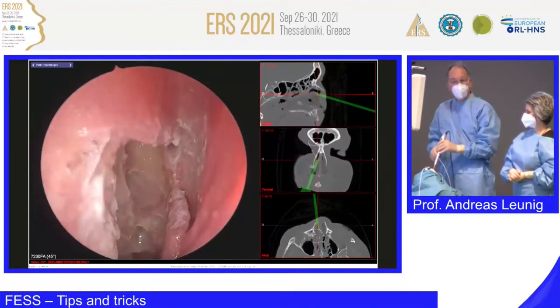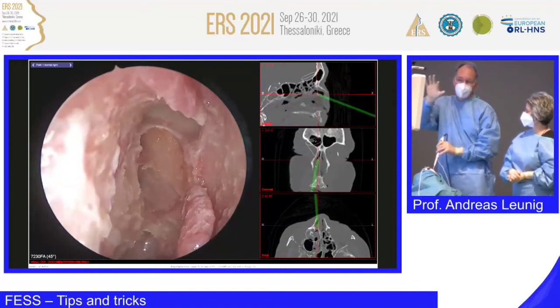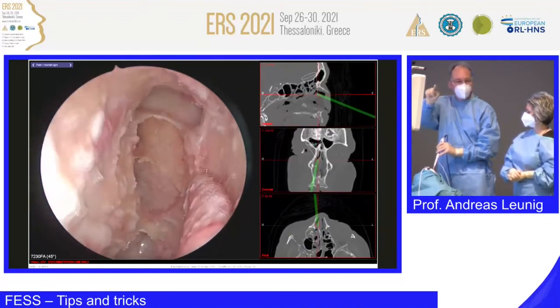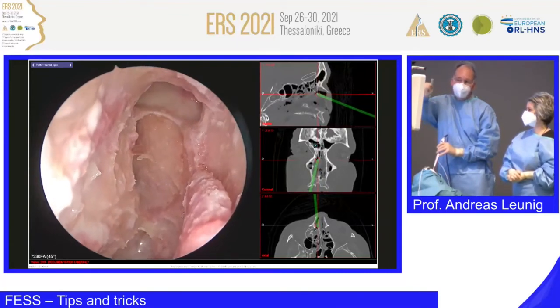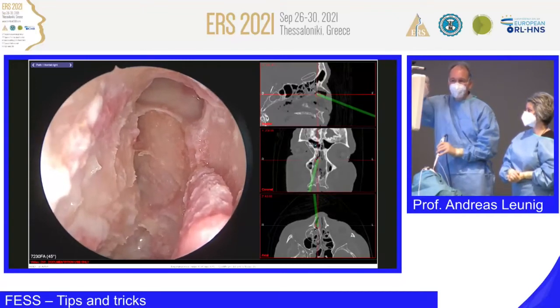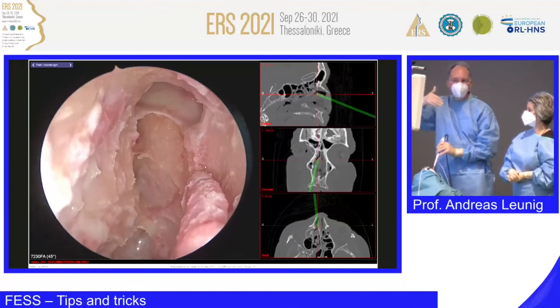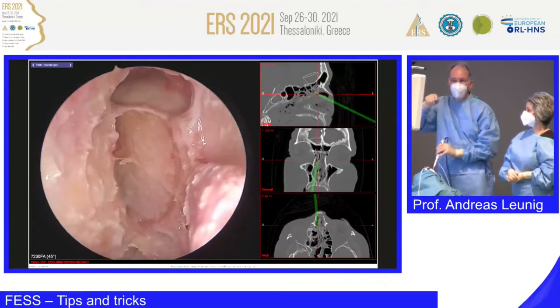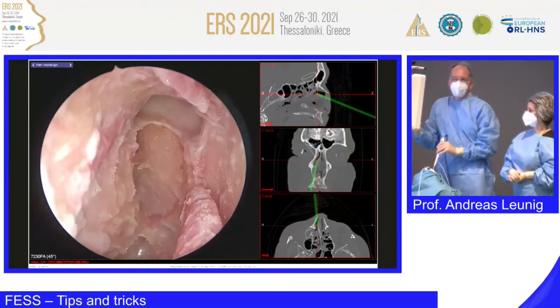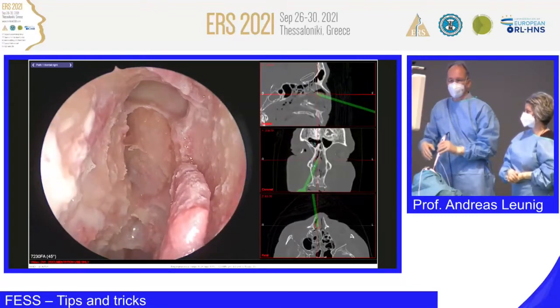For a type 3 opening, there's a difference because you have to resect part of the septum to make a window which is 2 to 3 centimeters wide. Then you do the same on the other side like I have done here. You resect the septum, the floor of the frontal sinus to the interfrontal sinus septum. You can even resect a part here. I don't do a complete resection to the highest point, but I open it widely. Even a type 3 opening makes sense in some rare cases, but this is not the focus of what we want to show you today.